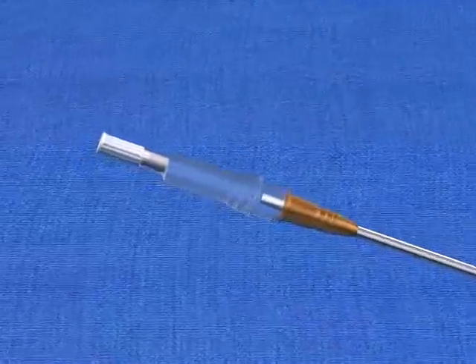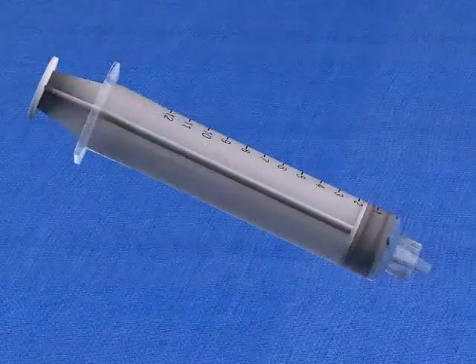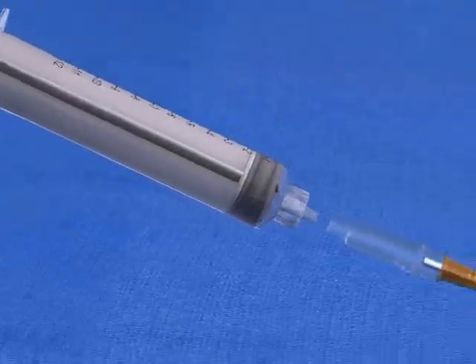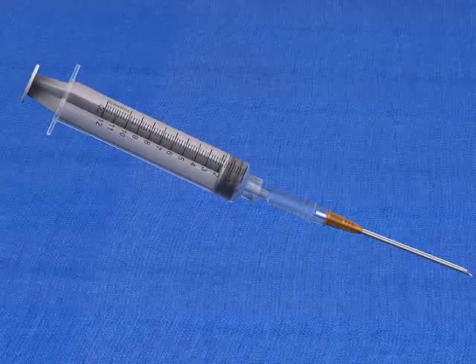If using such a catheter assembly, remove the cap from the flash chamber prior to insertion. A syringe, which allows for aspiration during insertion, may optionally be attached to the back of the catheter. The use of a syringe provides tactile feedback during catheter advancement.